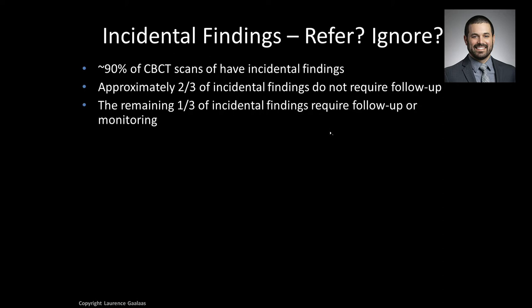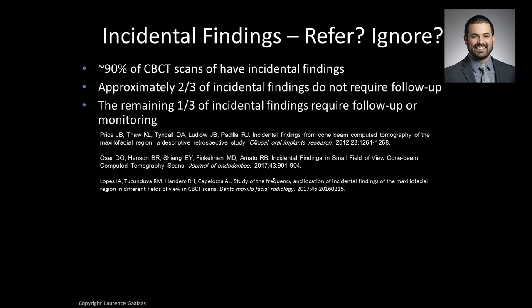That might be as simple as asking, hey patient, are your sinuses bothering you, or is this bothering you? And if the answer is, yep, I'm asymptomatic, you're done. It may be as aggressive as an immediate referral for biopsy or oncology, et cetera, in rare cases. And if you want to read more about these findings, I've got citations here for you. You could just do a quick library search for cone beam CT incidental findings, and it would bring up any number of these papers.